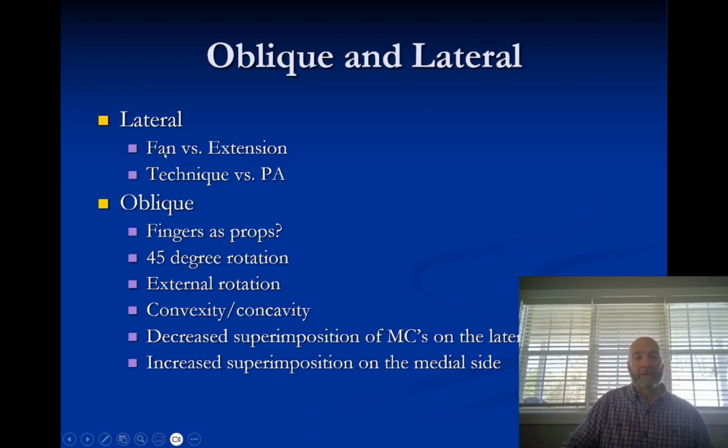So with a fan lateral, what we're going to do is take the fingers and separate them a little bit. You can take the fingers and ask the patient to make an okay sign like that, and make sure that they do it loosely. What you'll see sometimes is that the patient likes to really make a good okay sign, like, mash your fingers together, and that's unnecessary.